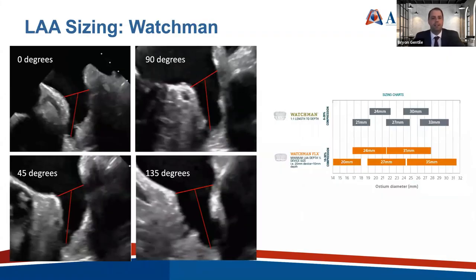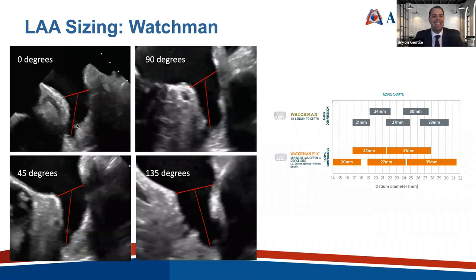Now we've entered the procedure for left atrial appendage occlusion and will begin sizing. For Watchman sizing, we size at four different angles: 0, 45, 90, and 135 degrees. I obtain what I find is a comfortable landing zone — the classic teaching is at the level of the circumflex artery, one to two centimeters distal to the atrial ridge. I measure into the deepest part of the appendage, which was more important for the Watchman 2.5 than for the Flex. There are sizing charts with overlap for both 2.5 and Flex to help decide which device to use.